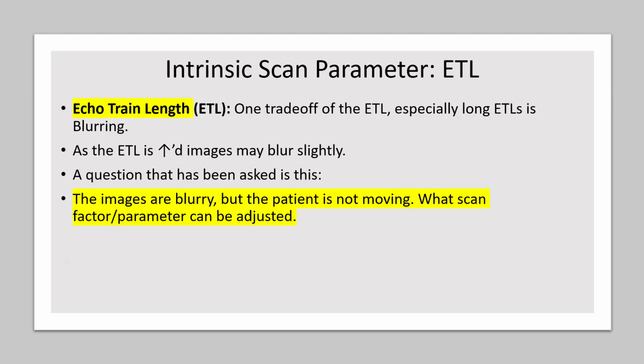And they're going to give you a list, okay? So if you said to yourself, well, what am I going to do? Should I increase my scan matrix? Nope. Because that's just going to make your scan time and your signal to noise drop. The patient's not moving, but I want to scan faster because that's everyone's fix, right?